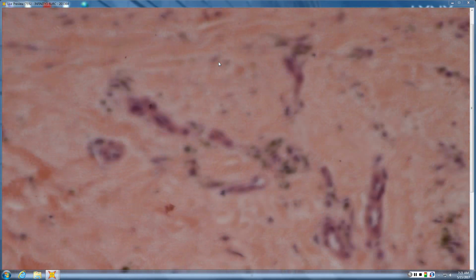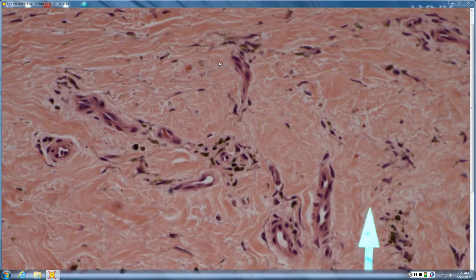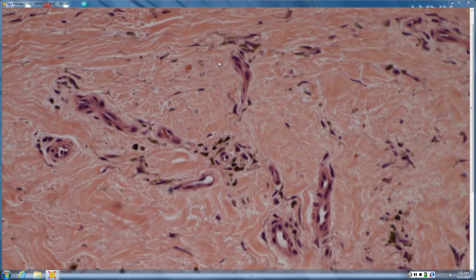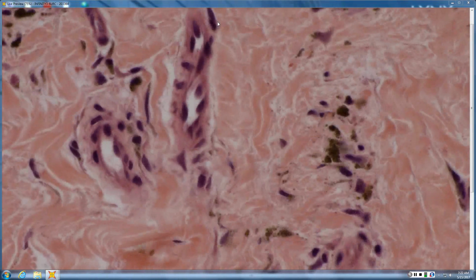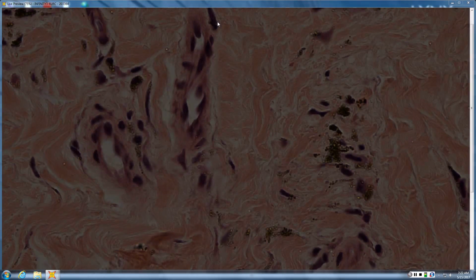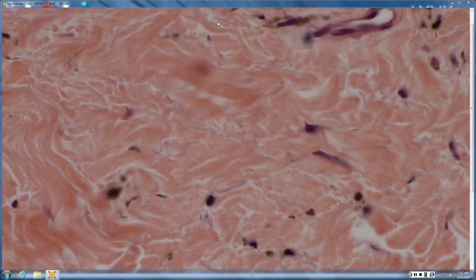And what would help you here is identifying the fact that these are large yellowish globules. So again, this is not that fine non-refractile melanin. These ones are a little bit more refractile and larger globules. And sometimes that condenser can help to identify that. So this usually would be even more that bluish gray clinical appearance, but is another reason for pigment in the dermis.